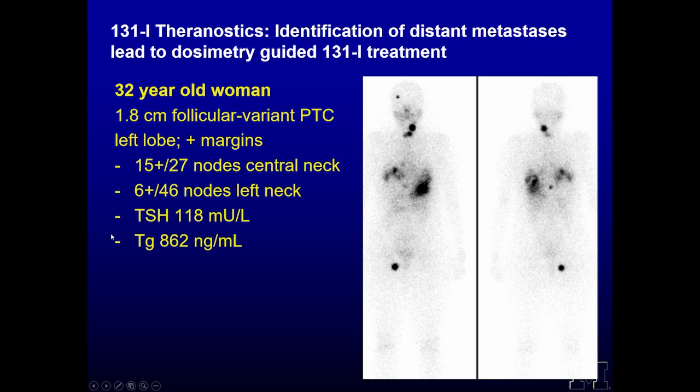Postoperatively, the patient is made hypothyroid, and biochemical testing reveals very high level of thyroglobulin consistent with residual tumor burden. And this is confirmed by the scintigraphic imaging evaluation showing the presence of diffuse bilateral pulmonary metastatic disease as portrayed by this heterogeneous radiotracer uptake in both lungs.